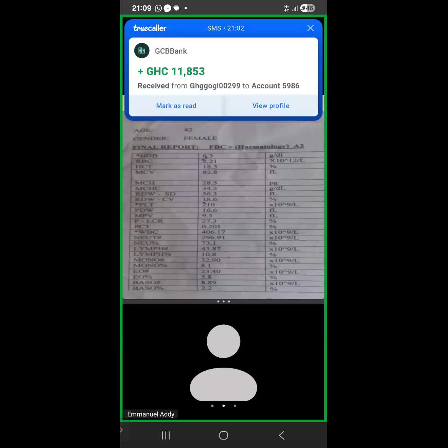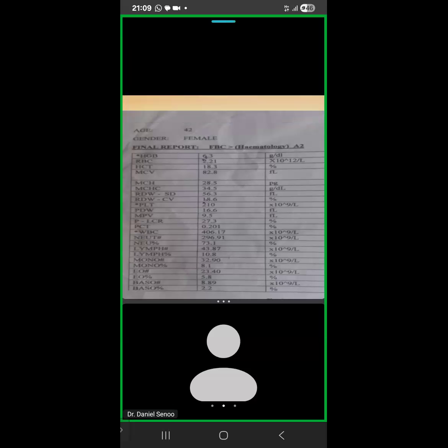Remember one of our colleagues. For me, I will see the variations in the RBC sizes, that is anisocytosis. I don't know which question you are answering now. Which question are you answering now? Concerning the RBCs you're talking about, the retics you're saying, with this result.